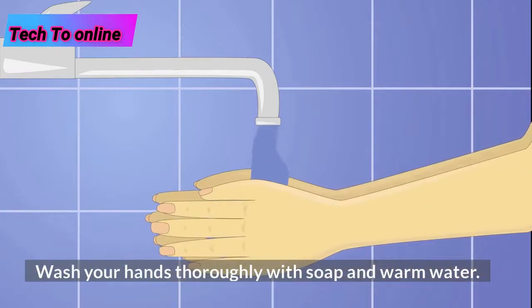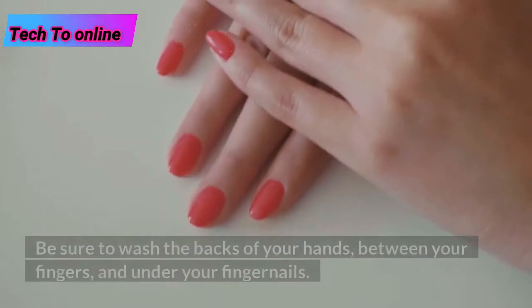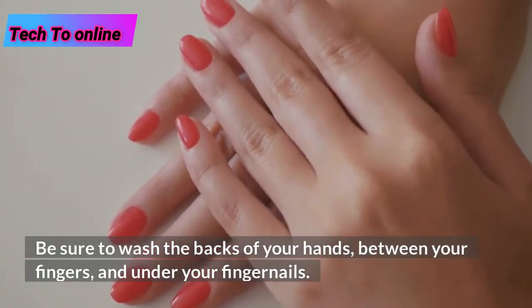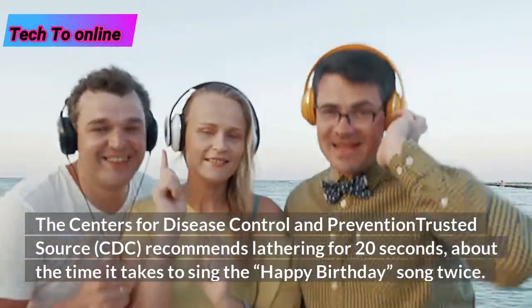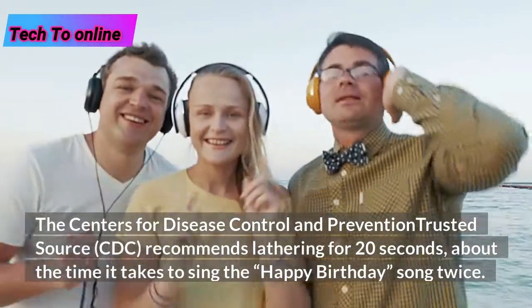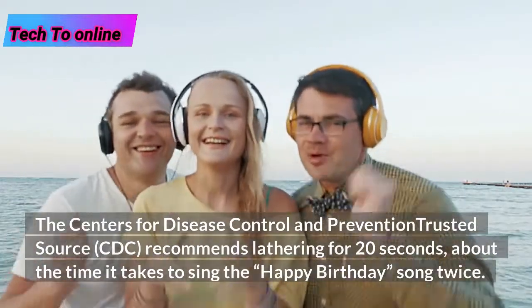Wash your hands thoroughly with soap and warm water. Be sure to wash the backs of your hands, between your fingers, and under your fingernails. The Centers for Disease Control and Prevention, CDC, recommends lathering for 20 seconds, about the time it takes to sing the Happy Birthday song twice.